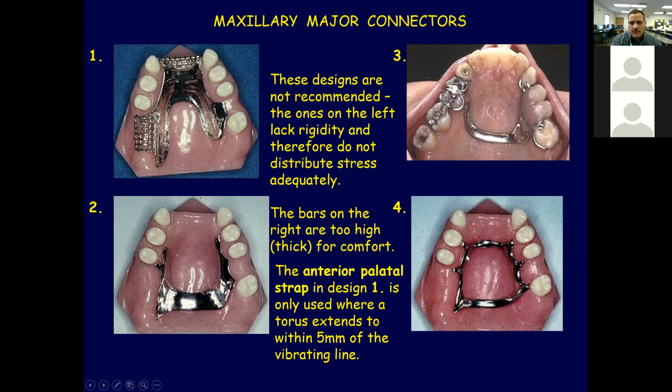Okay, this is another type of maxillary major connector for partial denture. This one, no one will do this. It's going to be on the back. Why would you do that? I see it just in the book. We never do that.